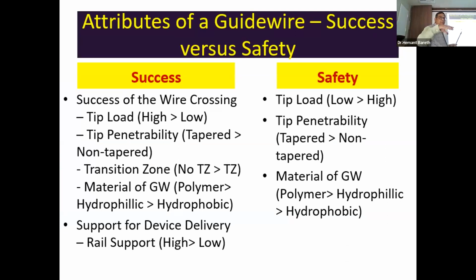I think the deliverability part is also something where it's a transition. So where the transition happens, that can make the movement of the wire easy or fail.